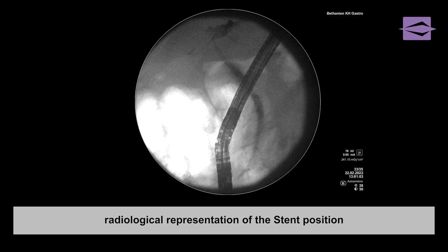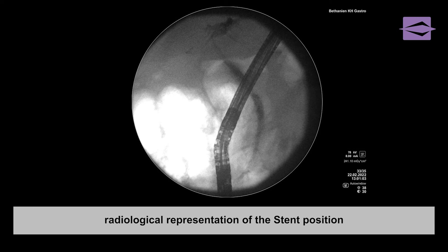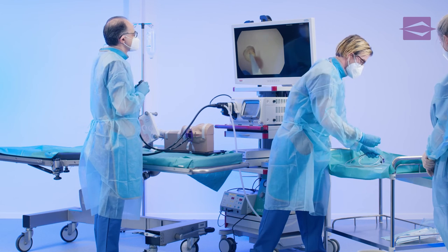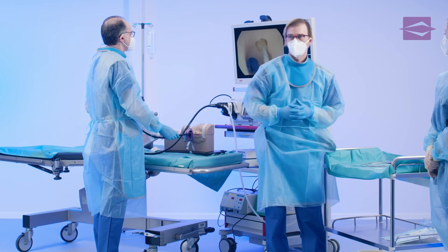A radiological control of the stent position concludes the ERCP. You saw a demonstration on endoscopic retrograde cholangiopancreatography, discipline: biliary stent placement using a stent placement set.